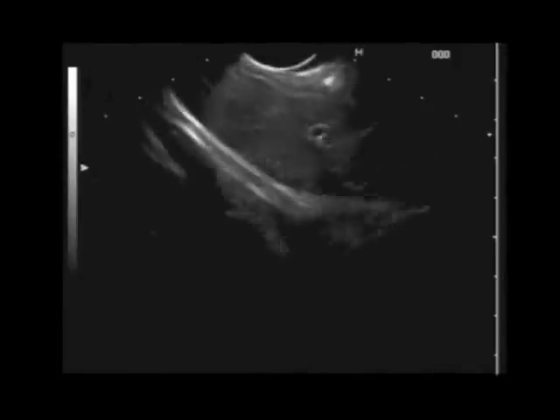I'm just trying to make sure there's no liver metastasis. You see some aerobilia, but the image is a little sharp. I don't see liver metastasis here. And this part of the liver as well.